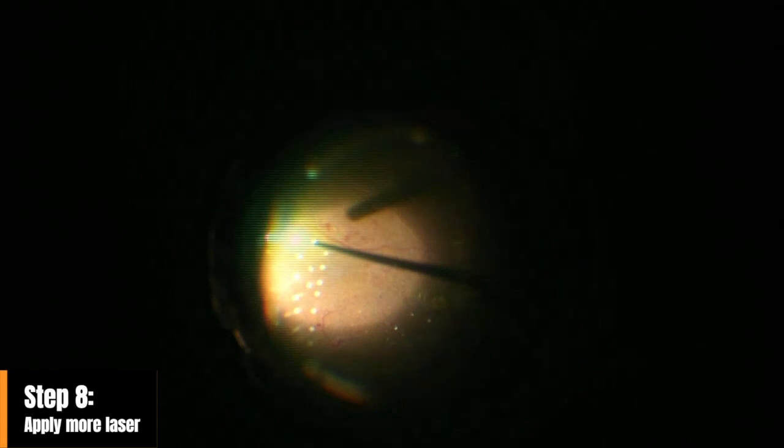Now, as you may know, in every diabetic patient, after you have completed the vitrectomy, always apply laser treatment. Here, as you can see, PRP had already been applied, yet the retinopathy progressed significantly. Therefore, even in areas that have already been treated with laser, apply more laser. Believe me, this will help the most in preventing rebleeding into the vitreous cavity and keeping the retinopathy in check.